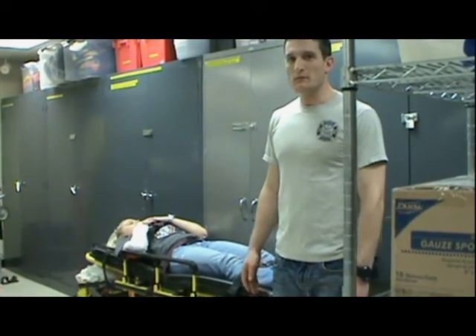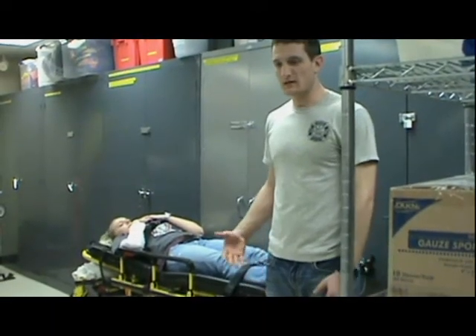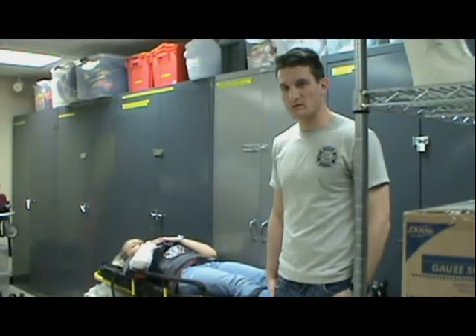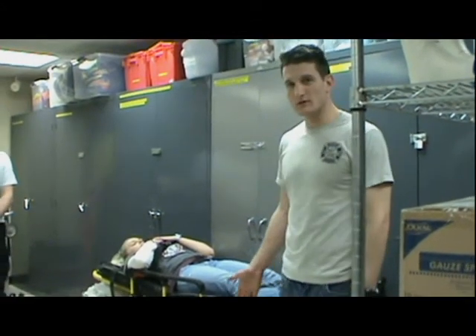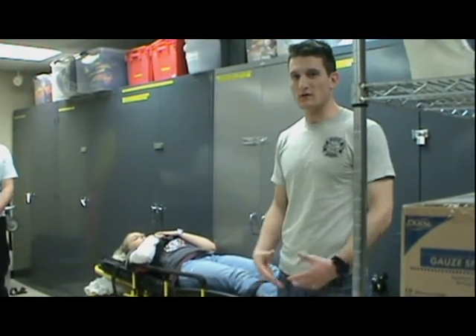Don't drop it all the way down. Always use good lifting techniques — lift with your legs and not your back. If you go lower, obviously it's a lot harder to lift.